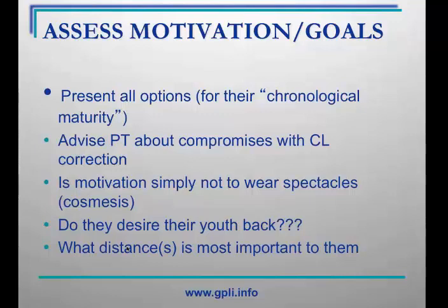These are also the individuals who, in some cases, are very critical about their vision. And with those patients, you may simply have to say you cannot guarantee that their vision will be identical to that achieved with glasses, and let them make the decision as to whether to proceed or not. Fortunately, there are very few people in that category. And then finally, find out what distance is most important to them, and have them rank the importance of their visual tasks, which typically include distance vision, computer vision, ability to read fine print, as well as their ability to read their smartphone. Your goal is to meet their primary visual needs.